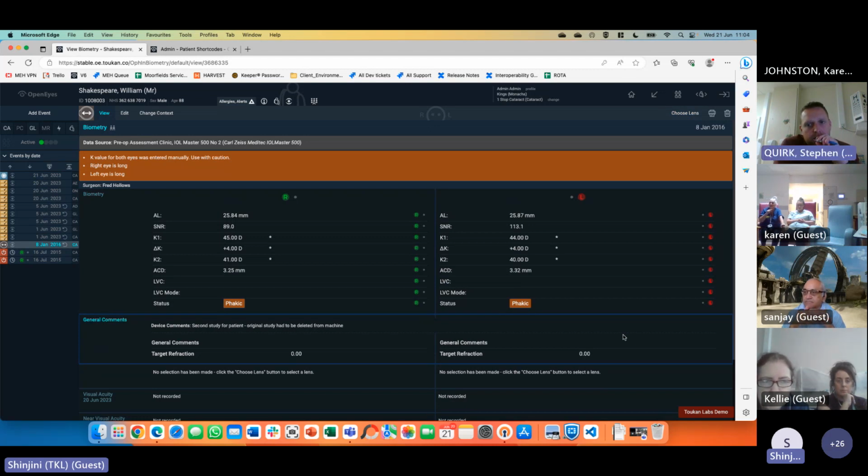Okay. Thank you. So if you have the Zeiss Forum, that makes your life easier. If you don't, then you have to go around configuring each device to send us information. In Forum, you can just direct the output feed as a one-off setting. We do have Zeiss Forum, and that's our intended route. Perfect. Easy on both sides then.